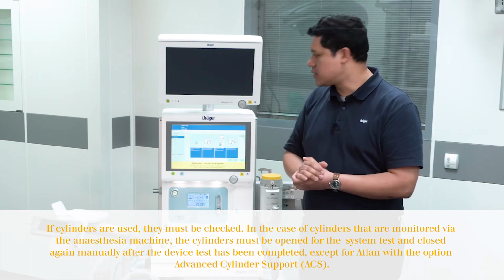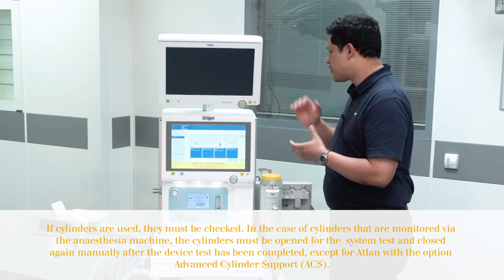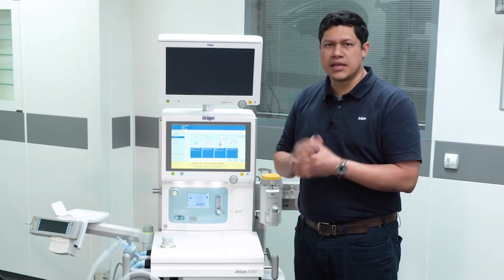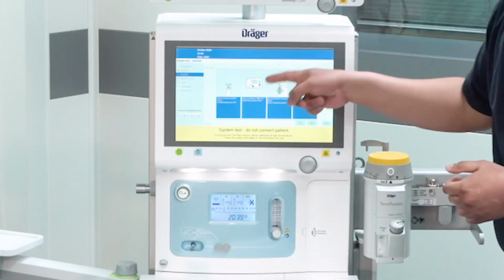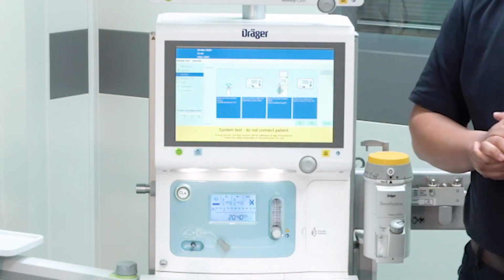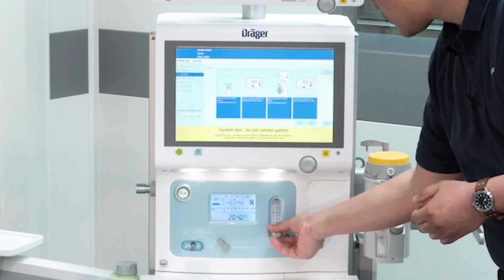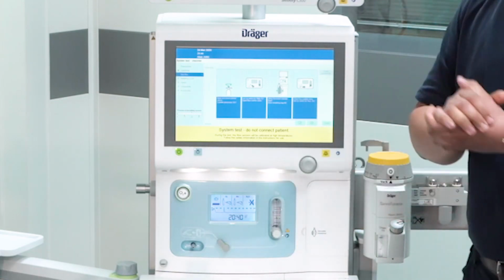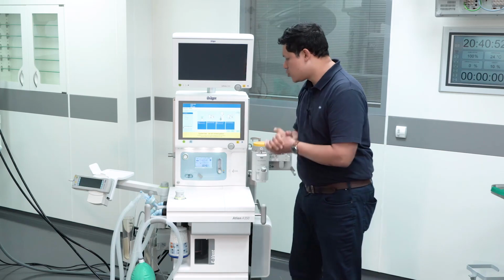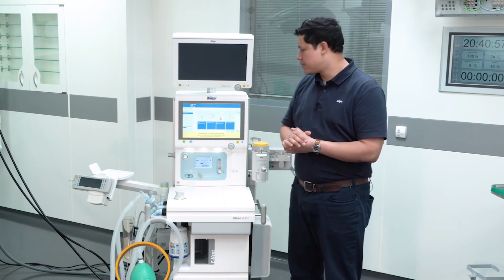The next group of tests are related to the gas flow. The first one is to verify on the back of the anesthesia device the pressure on the backup cylinders. The next steps are set the O2 switch to the oxygen position and open the oxygen flow control. You should verify that the flow meter is marking a flow, and you should also verify that the filling is correct in the manual breathing bag.